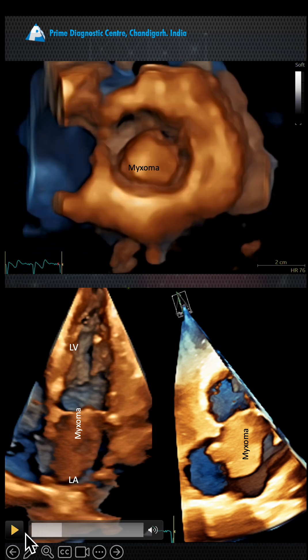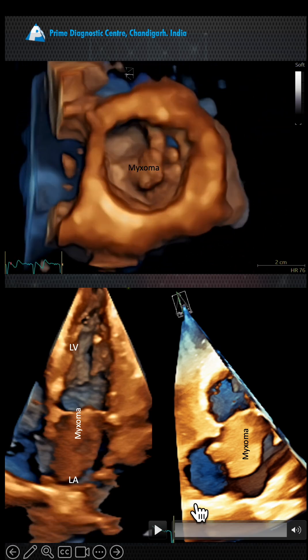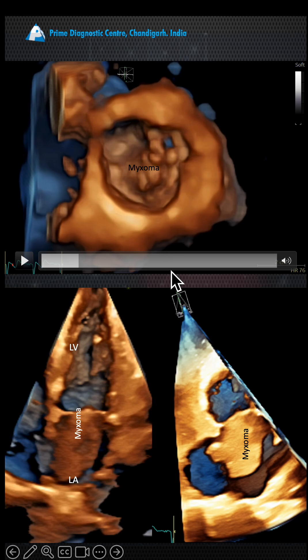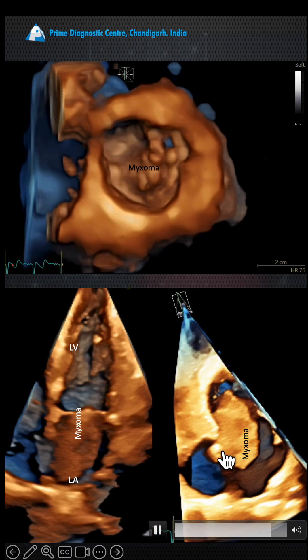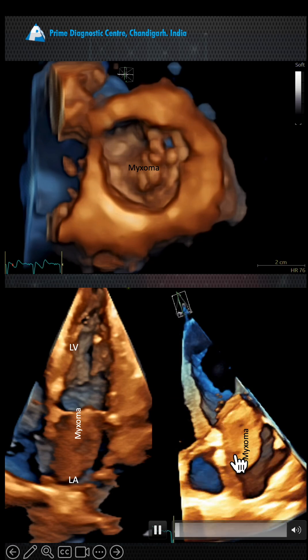You can see a central lucency. Our concern was whether we should try to look for where it is attached, because that's important for the surgeon. It was attached with a stalk which was quite thick, about 8 millimeters.